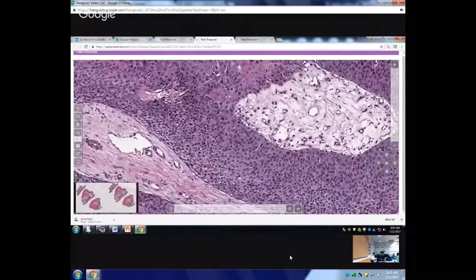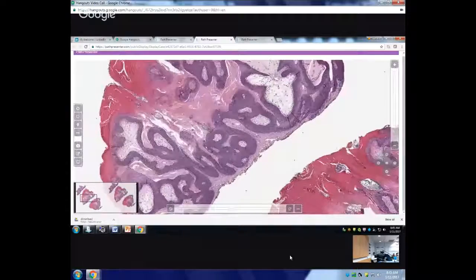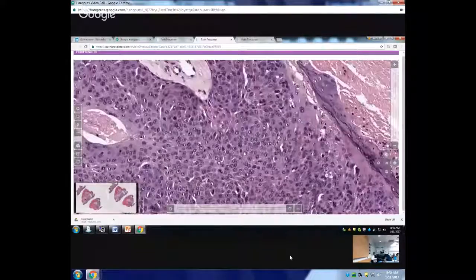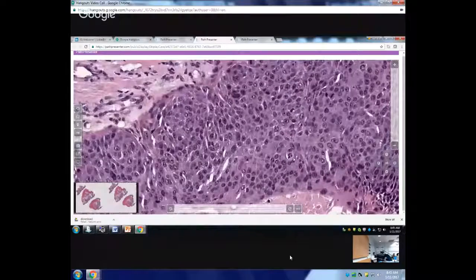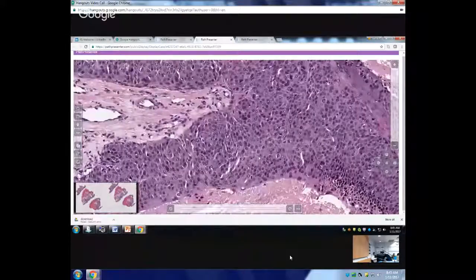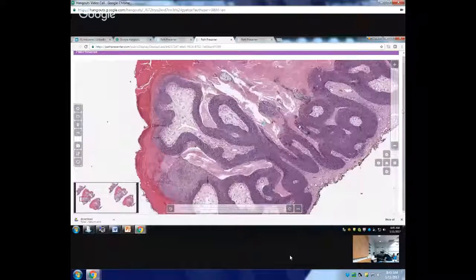Let's go back to the features now again. Like I said, it is still an epidermal neoplasm composed of basaloid cells, has blood vessels in the stroma, but the cytology is pretty atypical actually. Look at all this hyperchromatic nuclei. This is a mitosis here. There's another tripolar mitosis here. So you know you're dealing with an atypical neoplasm. And the most common neoplasm in this adnexa is the porocarcinoma. So when you start seeing all these atypical features, the diagnosis becomes easy.